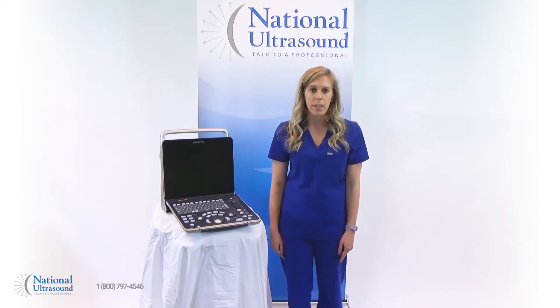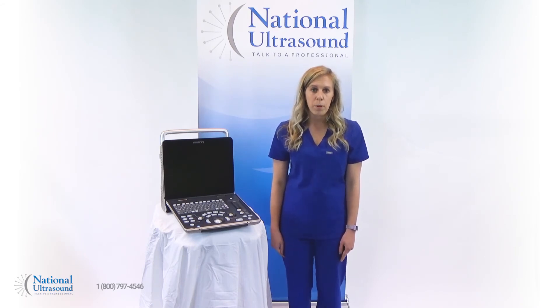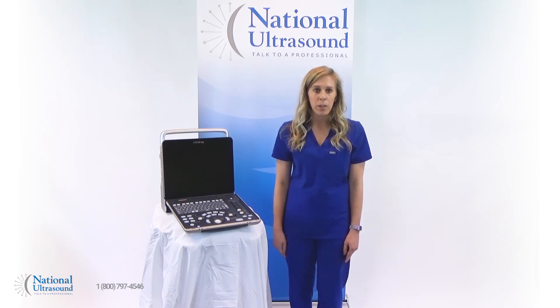The Mindray Z60 comes with an industry-leading three-year manufacturer warranty. The Z60 outperforms similarly priced machines and offers features and image quality found on machines two to three times more expensive, making it the perfect solution for practices looking to maximize value and ROI as they expand their ultrasound offerings.